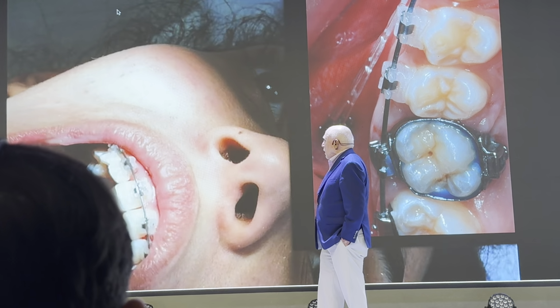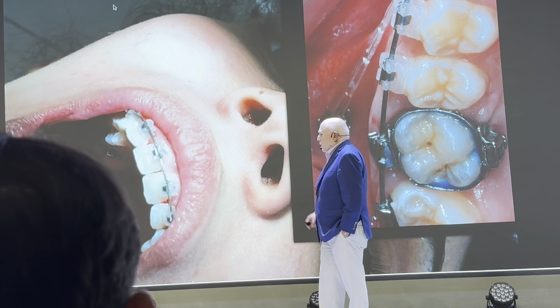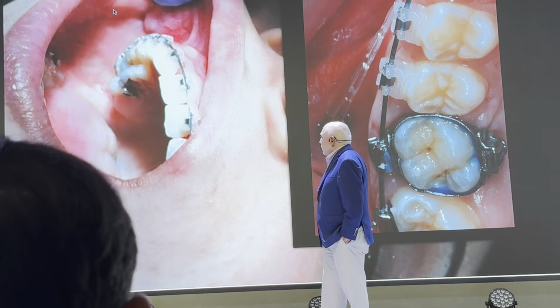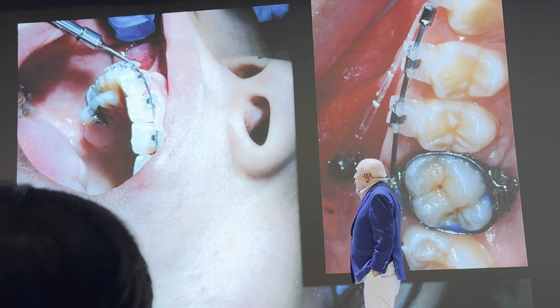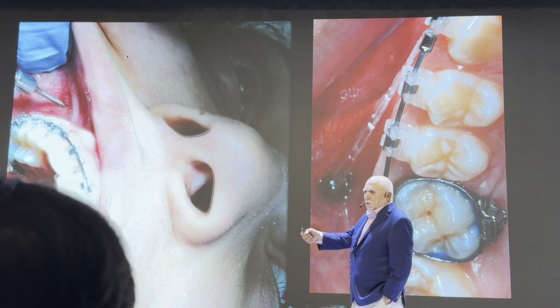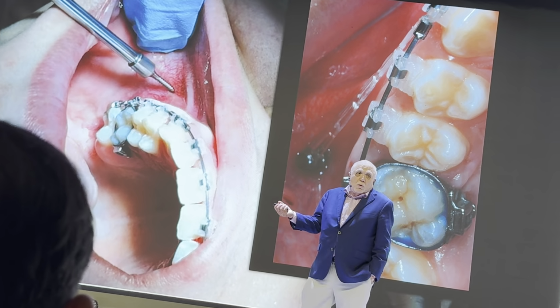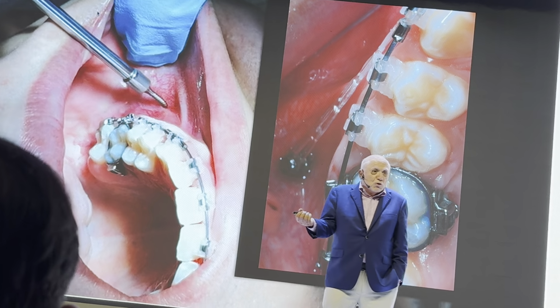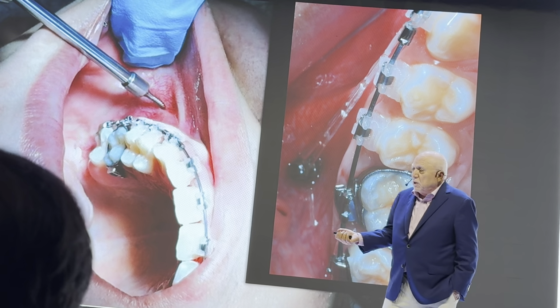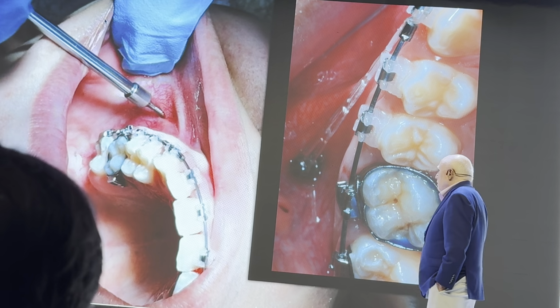Now you're going to take your screw. It takes about 5 minutes before the infiltration has taken place. And now you're going to take it, and with the hand you're going to basically turn. This is an actual movie, just to show you how long it is going to take. 1 minute and 34 seconds.